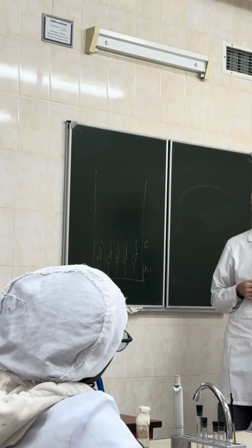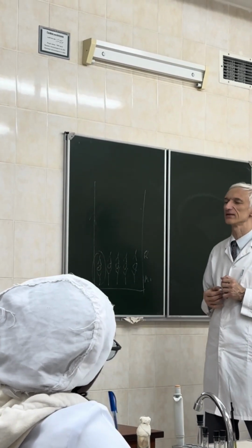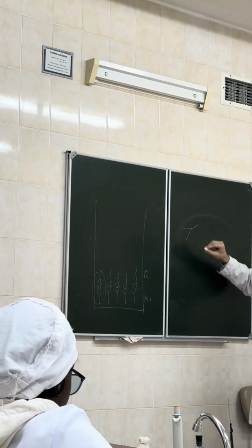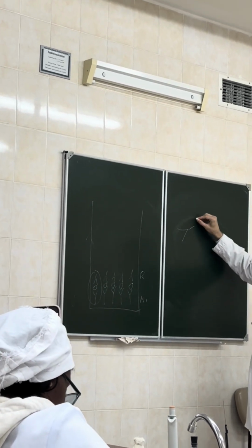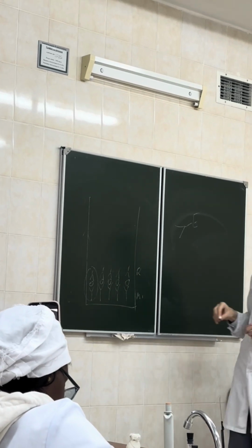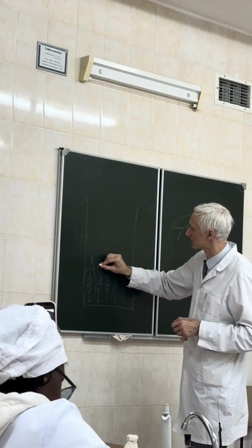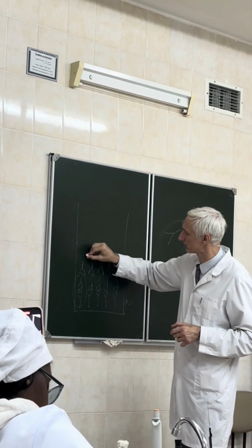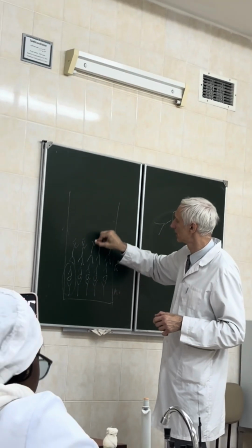Antibodies for the antibody. Definitely so. Anti-rabbit antibodies, moreover, will be not simply antibody, but a so-called conjugate, coupled with an enzyme like horseradish peroxidase. So that's why we add anti-rabbit antibodies labeled with enzyme. The enzyme will be, as I said, peroxidase.